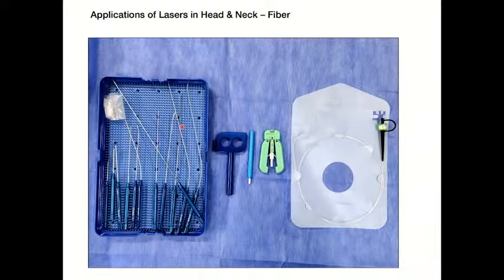As for the fiber, as sir mentioned previously, it can be channeled through these applicators. It comes in handy when you're dealing with transoral laser surgery of the vocal cord, especially the anterior commissure, where with the free beam you're not able to direct at the lesion. You may be able to excise every part, but for that last bit we will not get the angulation right to go right up to the thyroid perichondrium. Sometimes this angulated fiber comes in very handy. But this fiber is very expensive.